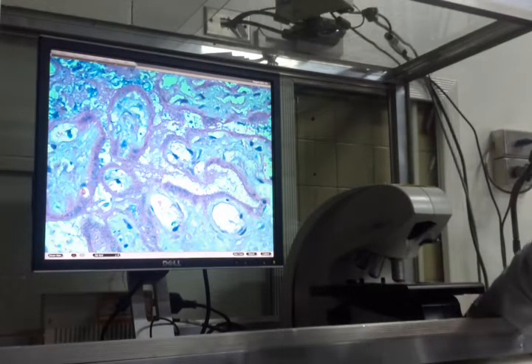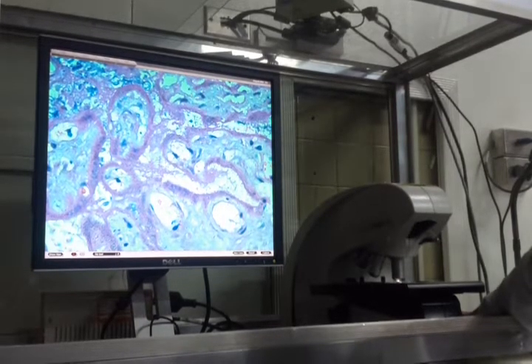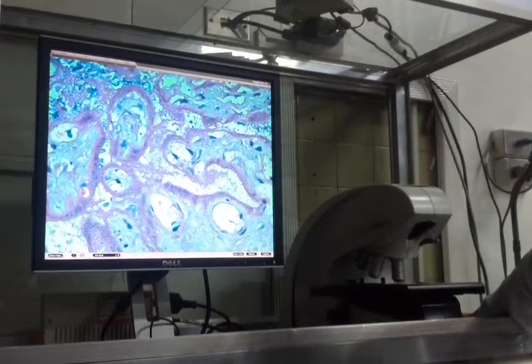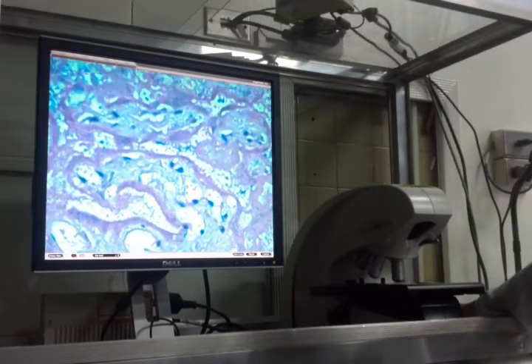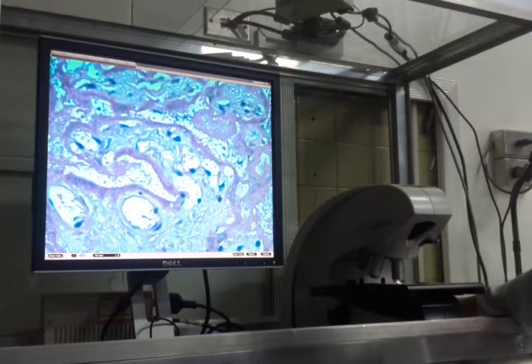Where is the lining epithelium or the lining cell of this chorionic villi? Wala nang cytotrophoblast, wala nang syncytiotrophoblastic cells. Tama? Pero nare-recognize nyo pa ba siya as chorionic villi? Oo, dahil sa size and shape niya, di ba? May mga butas-butas pa for the blood vessels. So you have the architecture, but you don't have the nuclei.